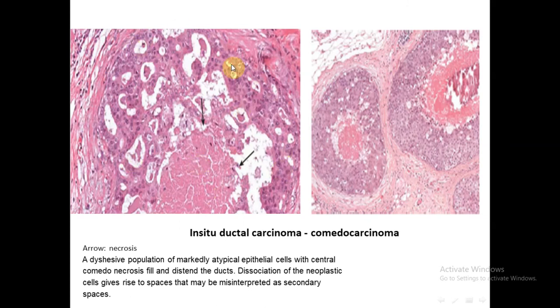This is in situ ductal carcinoma of comedocarcinoma type. We see here proliferation of high-grade malignant mammary epithelial cells with prominent features of malignancy: pleomorphic, hyperchromatic nuclei and high nuclear-to-cytoplasmic ratio. In the center, there is comedonecrosis — necrosis in the center of the lesion. Here we have the necrosis surrounded by high-grade malignant cells, with periductal fibrosis and chronic inflammation.